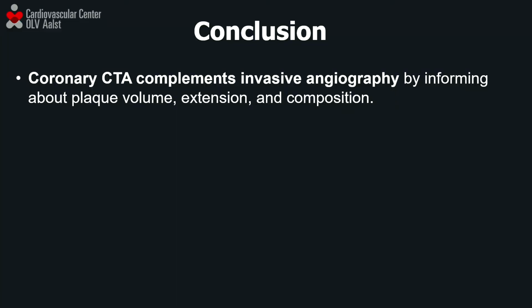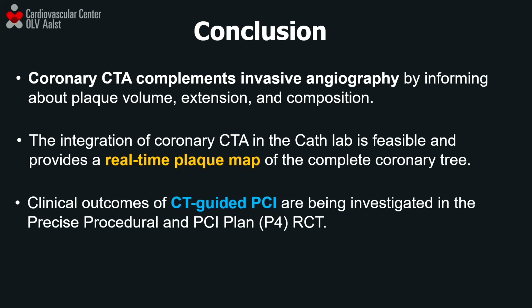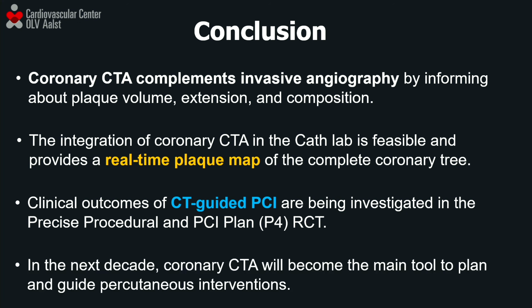So as a conclusion, coronary CT complements invasive angiography by informing about the plaque volume, extension, and composition. The integration of the CT in real time is today a reality. It's available, I can say, in almost 20 cath labs in the world that are participating in the trial. And we think that this approach will improve clinical outcomes. In the next decade, I think that coronary CTA will become a tool for interventional cardiologists to plan PCI.